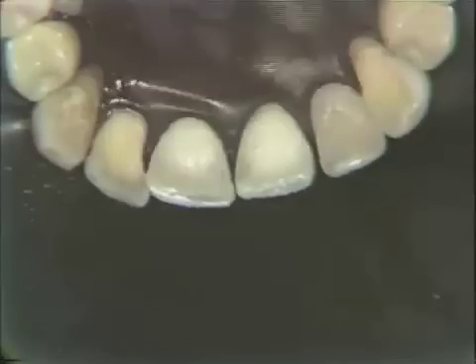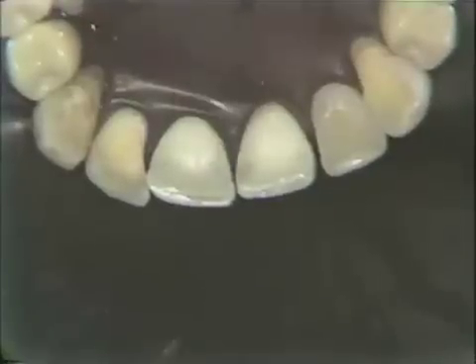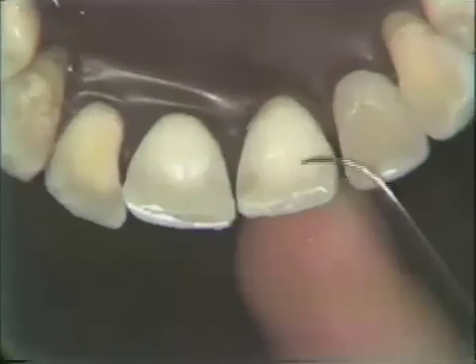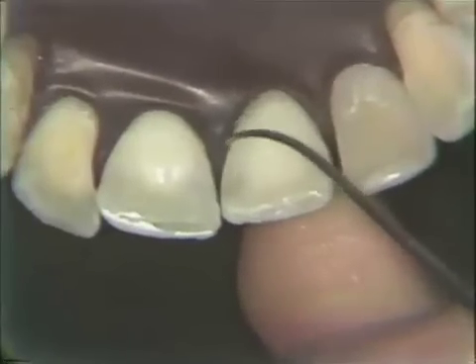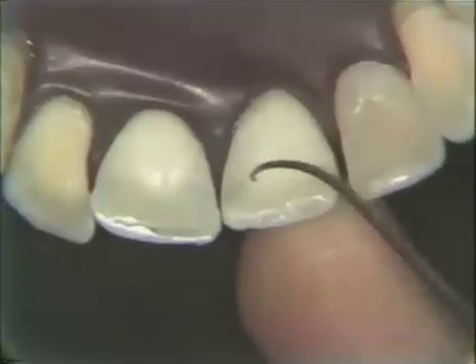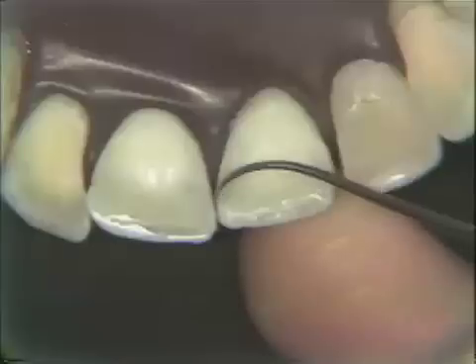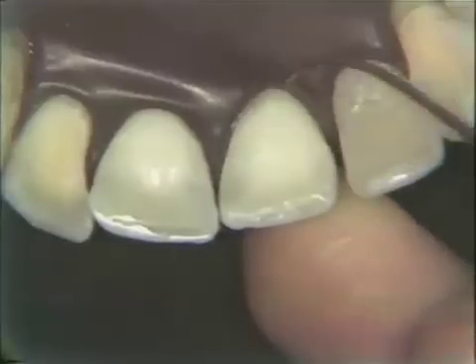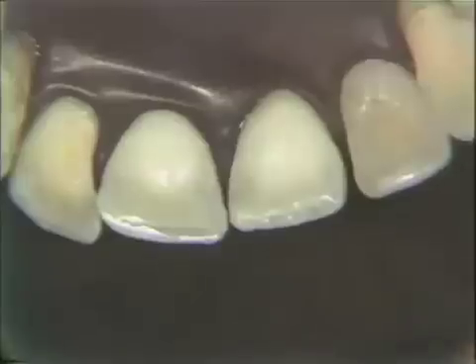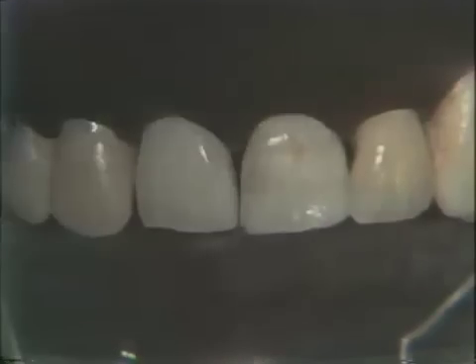I think you can see the cavity outline, now the cavity preparation outline, and how smooth it really is. It turned out very nicely, but we will check again. There is really no indication when we are going from tooth to restoration or from restoration to tooth. We have to remember that this did have a slight tendency to come out toward the labial. So now we will check the labial portion of this tooth.